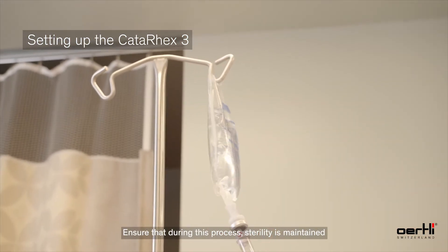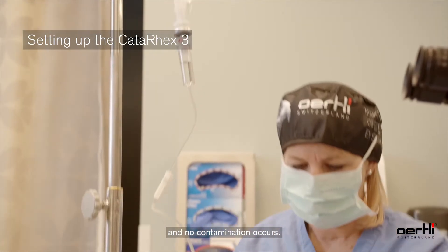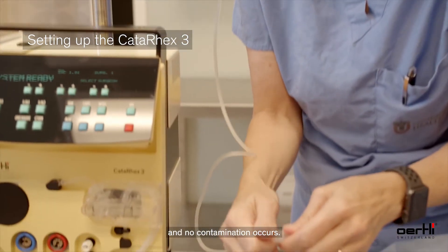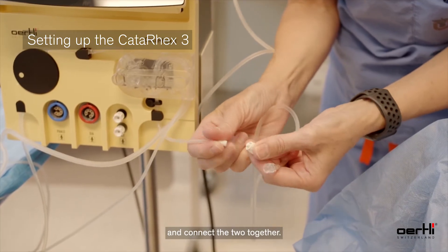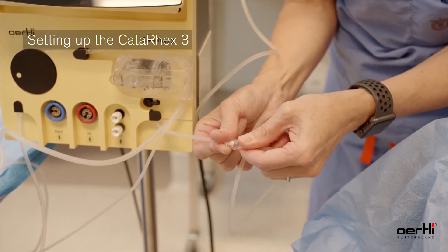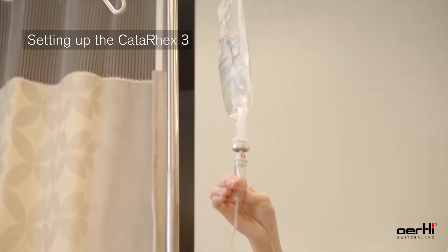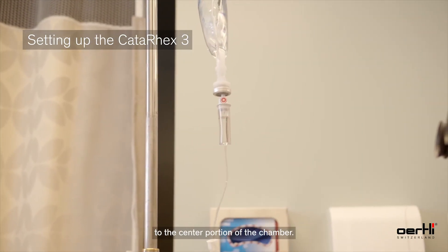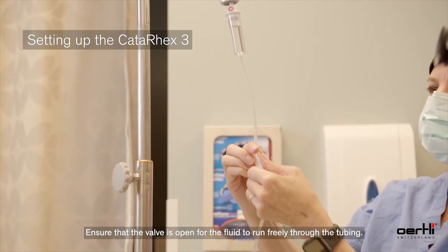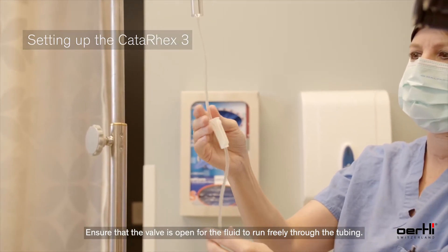Ensure that during this process, sterility is maintained and no contamination occurs. Break the cap off the spike bottle tubing and connect the two together. Ensure that you fill the chamber of the spike tubing to the center portion of the chamber. Ensure that the valve is open for the fluid to run freely through the tubing.